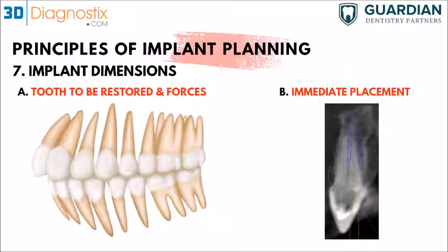That would also avoid the overheating we talked about earlier. With longer drills, it's more difficult to have irrigant reach all the way to the bed of the osteotomy, and that could lead to overheating. So I would only recommend using longer implants in sites where you have to place them immediately.